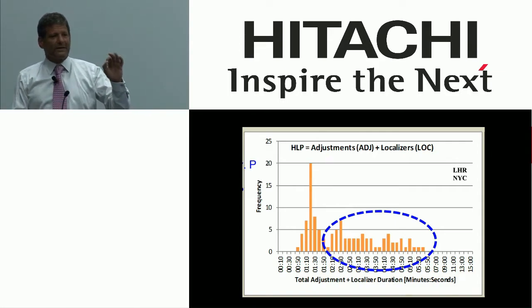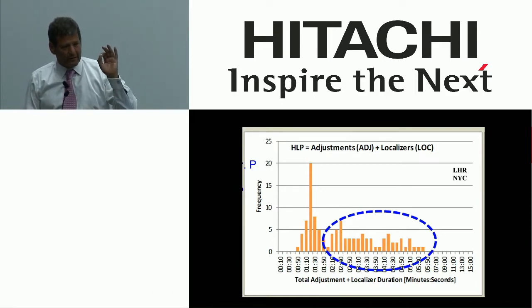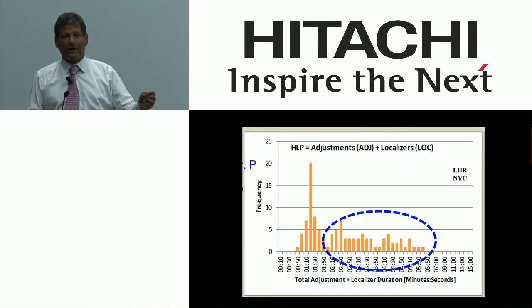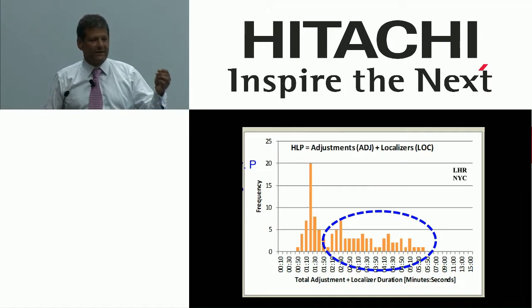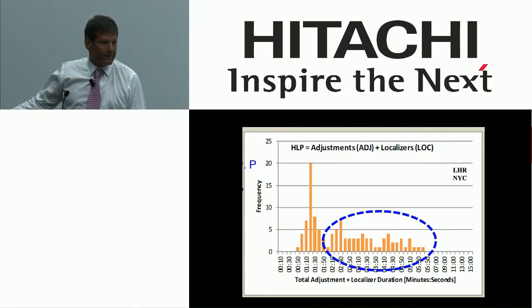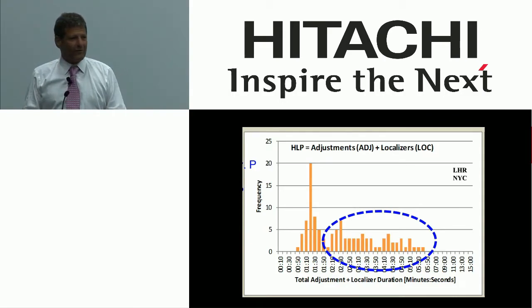I'm trying to do 30-minute slots. In a 30-minute slot, I have about 15 minutes to contribute to diagnosis. I have about 5 minutes to handle a patient on, 5 minutes to handle a patient off, 5 more minutes to deal with challenges, to deal with repeat scans, which hopefully we can avoid, and 5 minutes for the technologist to take a deep breath between cases so it's not a stress factory. If I waste them doing 5 minutes of localizers, I've already lost that battle.